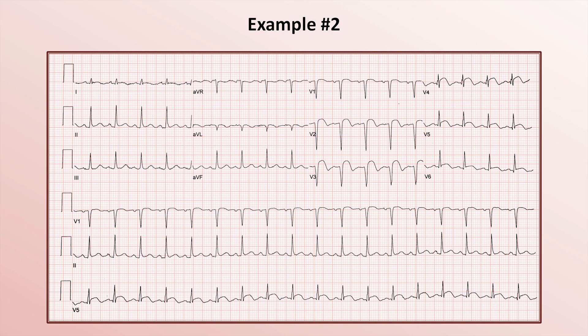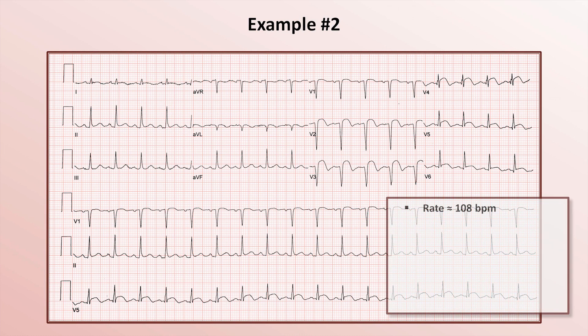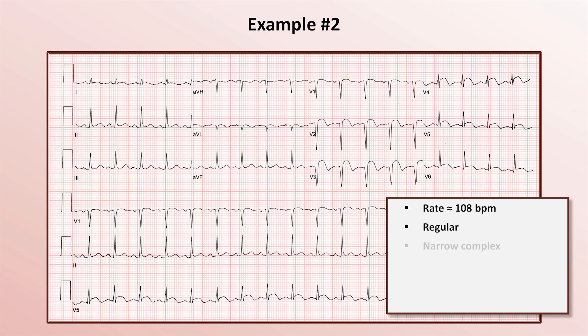For a slightly more precise estimate, which isn't generally necessary, we can use the 10-second rule. There are 18 QRS complexes across the recording, giving a more precise rate of 108 beats per minute. The rhythm is regular.